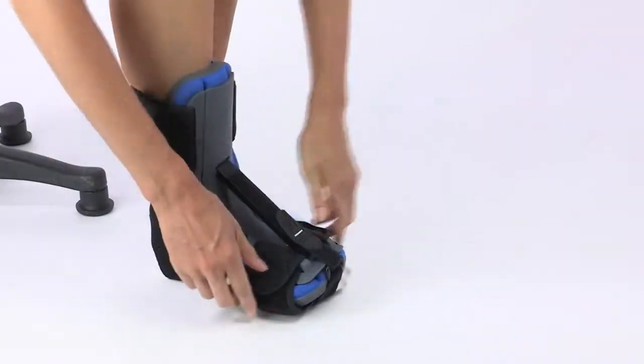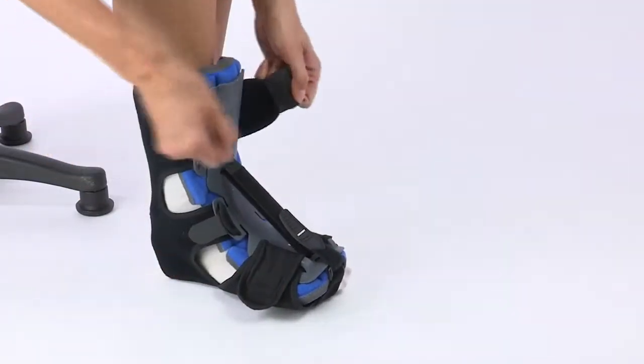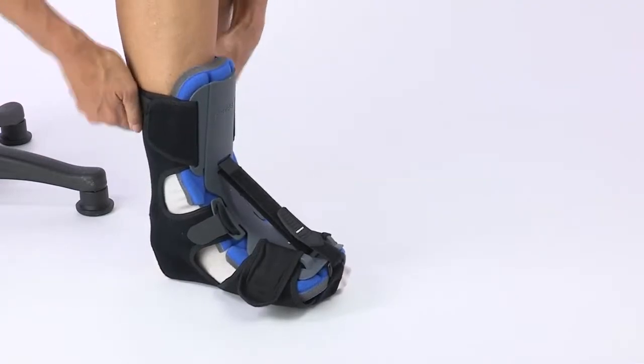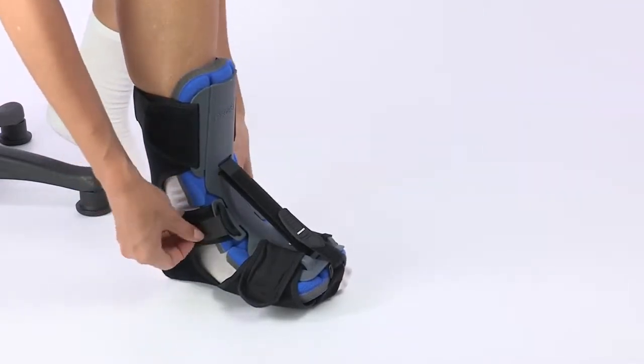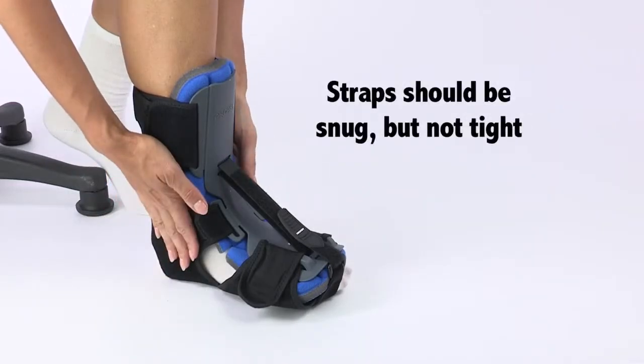Your heel should be comfortably seated within the heel cutout area. Once you have your foot comfortably positioned in the splint, secure the forefoot straps first, then the calf straps. Then, if needed, adjust the middle straps. Be careful not to over-tighten these. The straps should be snug, but not tight.